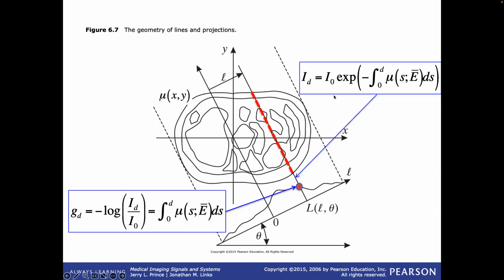I wonder what the precision is of that calculation compared to the precision of the detectors. So the question is, what is the precision of that calculation versus the precision of the detectors? And in some ways, it might normalize out because you are making the measurement of that intensity with that detector, right? So that's the data you have. And so you say, well, if I set my buttons to this and I measure an intensity out of my detector, it kind of normalizes out the sensitivity of the detector.